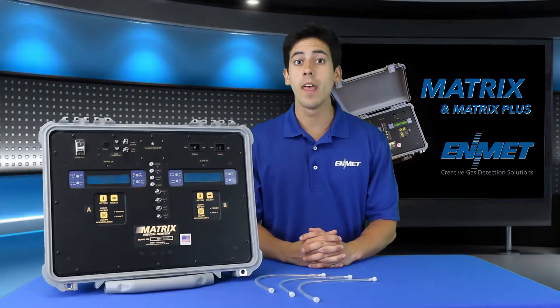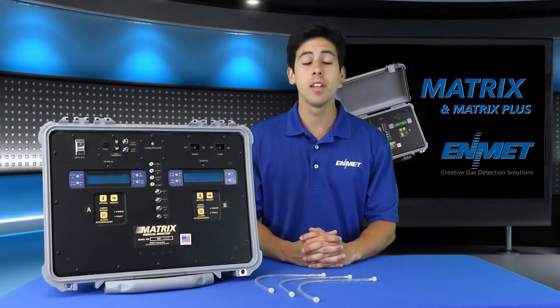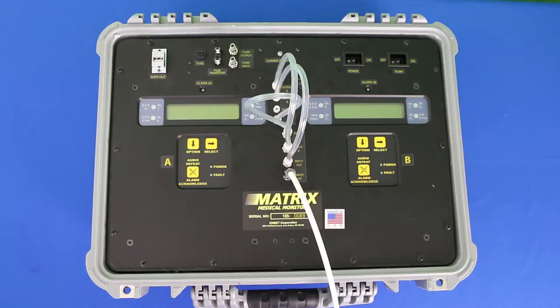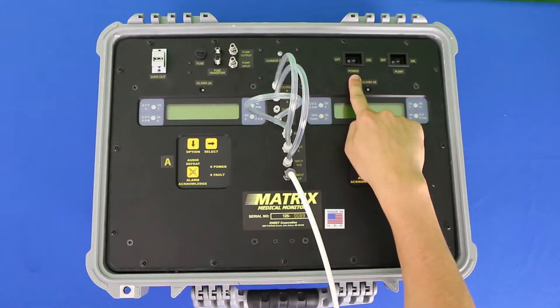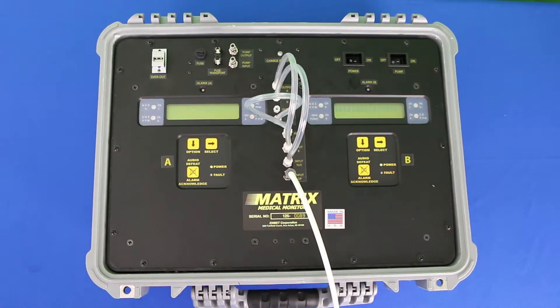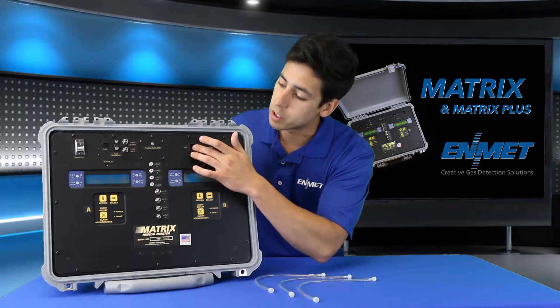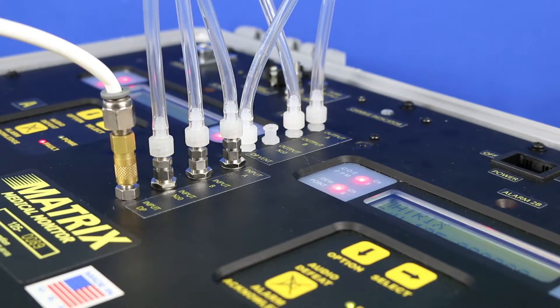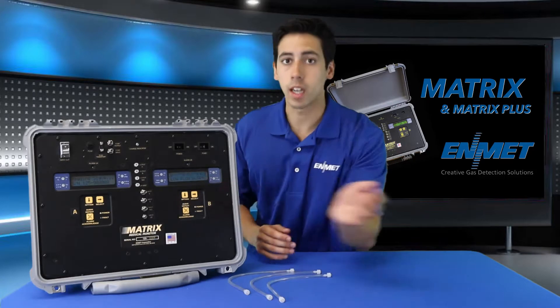Once these connections are made and the air supply is flowing, the next step is to turn the instrument on by flipping the switch labeled power, located in the top right area of the unit. Upon powering up, the instrument performs a self-test diagnostic and will bring you into the operational displays within a few seconds.